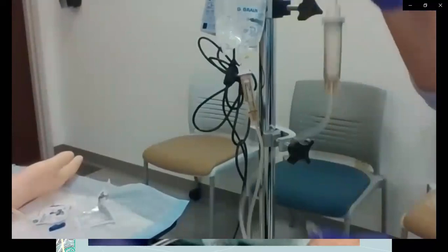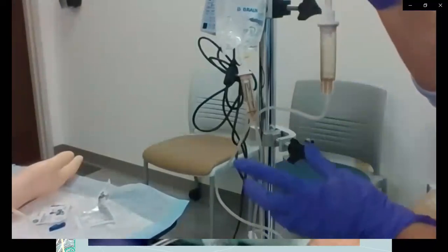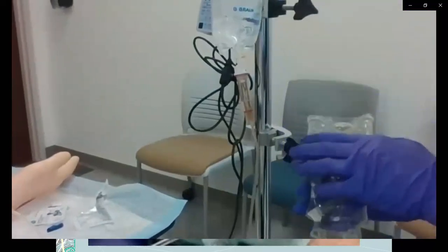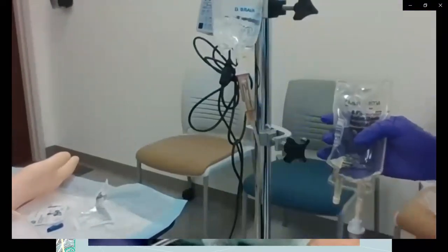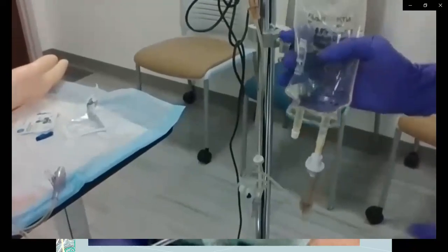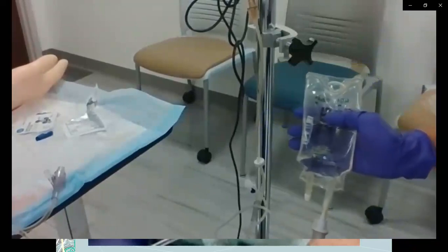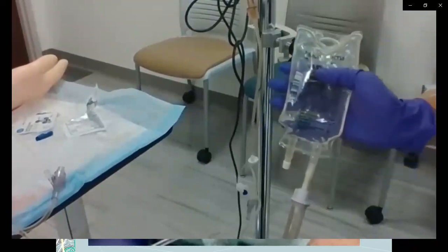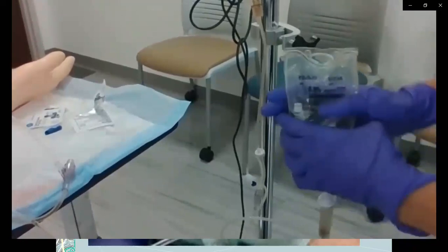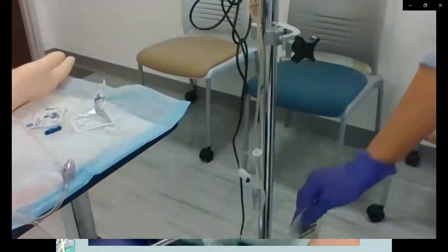So what we're going to do, I'm going to try to get this closer so you can see. Okay, I'm going to open up this clamp that's on the secondary tubing. If I lower it below my primary IV, you'll see that primary IV start to drip, okay? You see air bubbles starting. I'm going to lower this a little bit more. Air bubbles starting to come into my secondary line, right? The lower you take it, the faster it's going to fill up because that's the way gravity works. So we're going to do that until we get our drip chamber about halfway full. So you can hang that down real low.